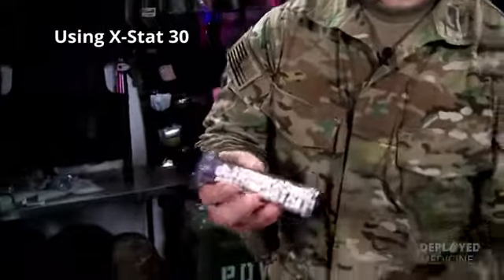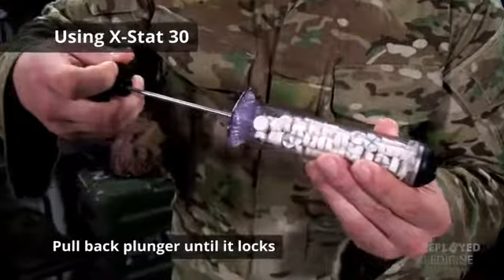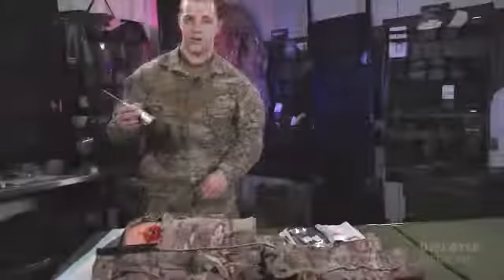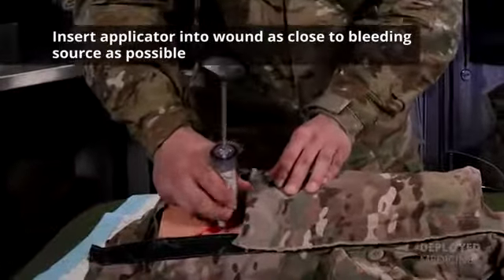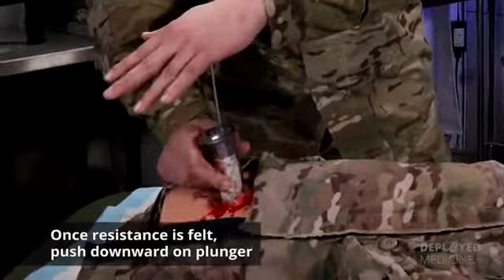Okay, so how the XStat works is the XStat 30. It's just a syringe, so all you're going to do is grab the plunger, pull back, set. Keep in mind that once it's locked, you cannot push the plunger back anymore. Insert the applicator into the wound as close to the bleeding source as possible. Once you meet resistance, simply push down on the plunger.